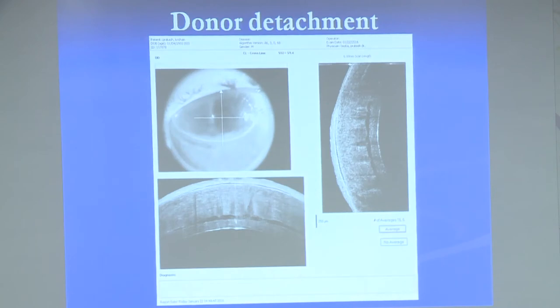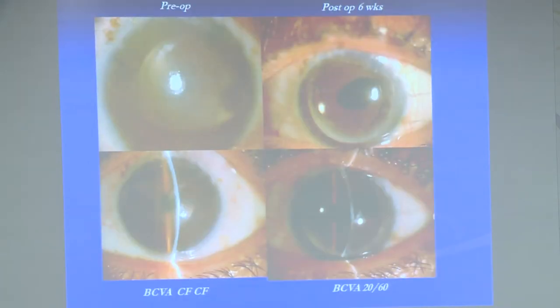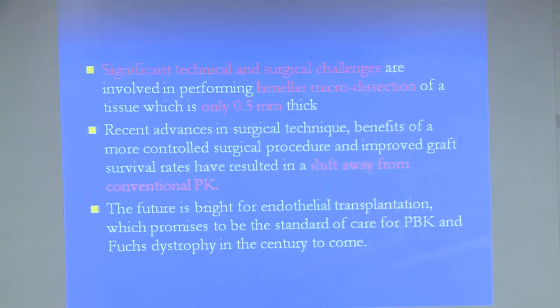You can have some complications, such as in this case where we detected an endothelial lenticule detachment, and you can confirm it by anterior segment OCT. After rebubbling, the lenticule was attached, and this was again documented at AIOC 2020. You can also do DSEK with IOL exchange, and these were the pictures of the same patient.